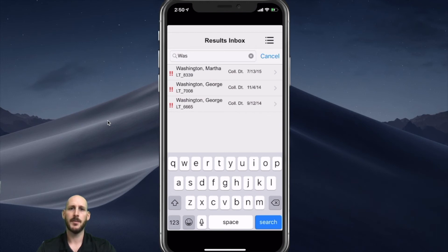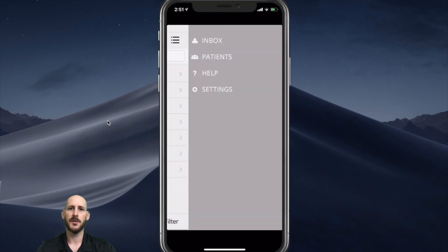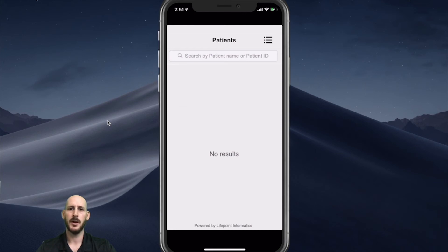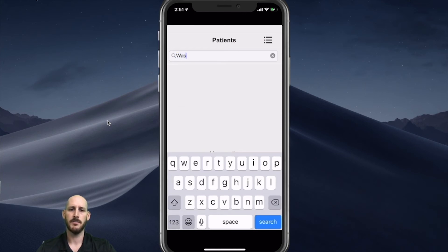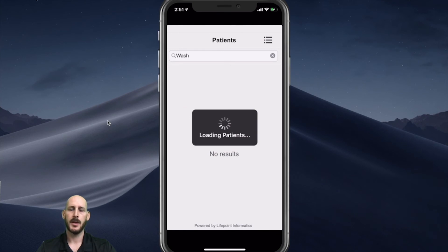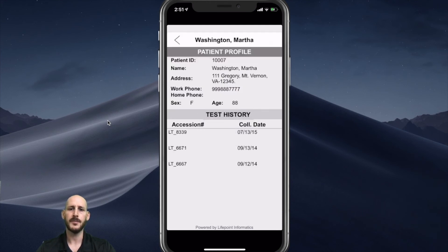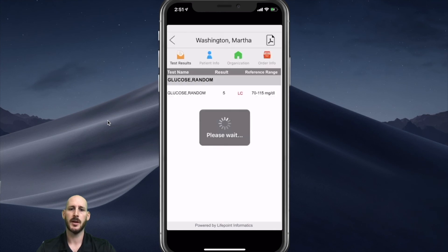If you click on the menu tab, you'll also be given some other functions. I can click on patients, and this will provide me with a result history on a given patient. I'll type in Washington — you only have to type in a few letters and it'll find any patient that meets that criteria. In this case I have George and Martha. I'm going to click on Martha, and it'll view any of the test history that's available for Martha. If I want to view a report again, I can just click on that report and it'll display that result.